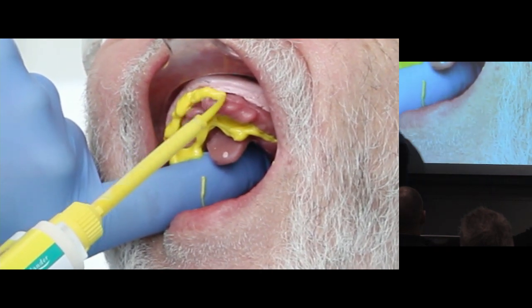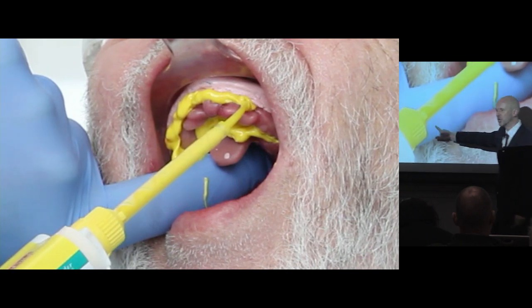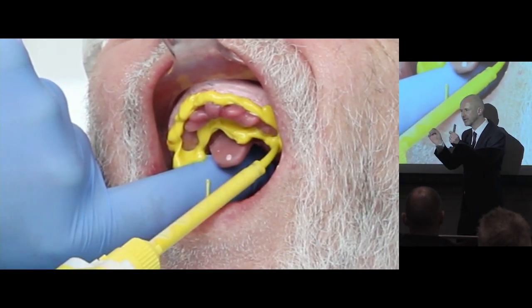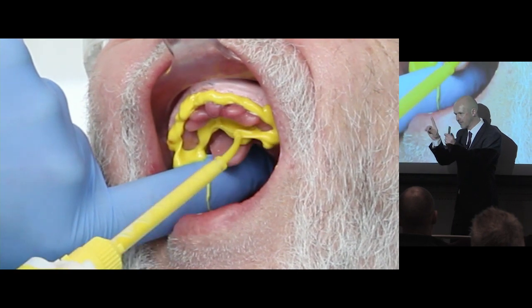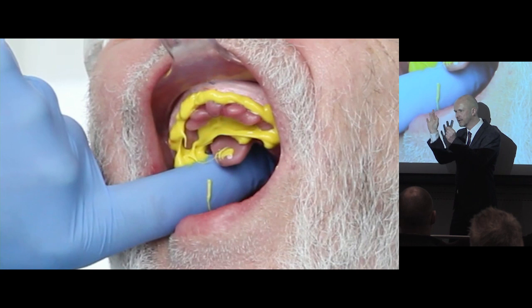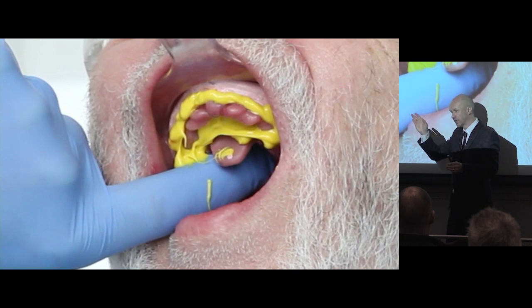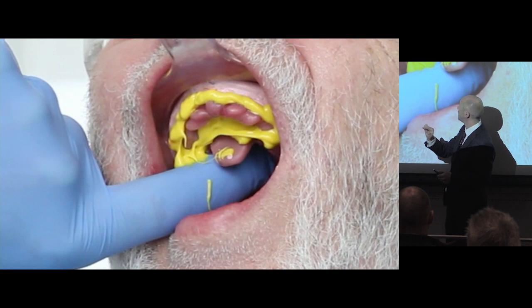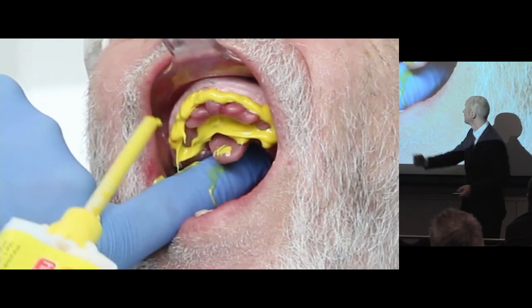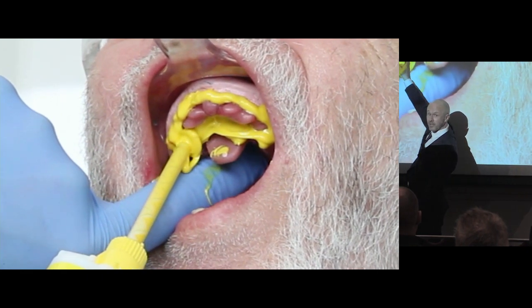And then here I have a very light-bodied silicone impression material with a fine tip on. The fine tip's really important, so I'm beading it around the border of the tray, so we get a lovely blend between the zinc oxide and the silicone impression material, all the way around the border. And then I've got another cartridge set up on the side without the fine tip on here.